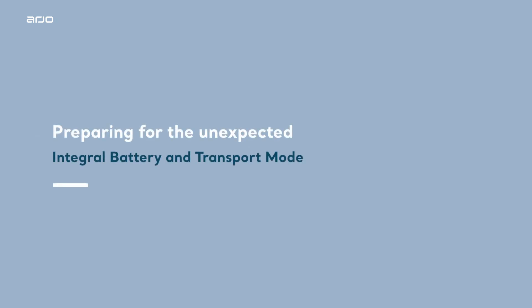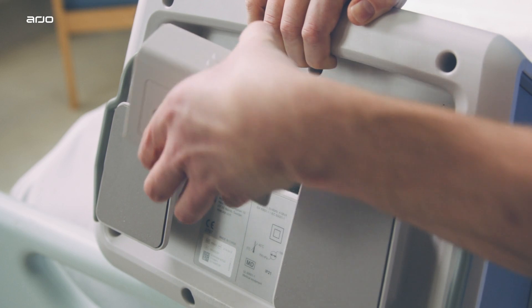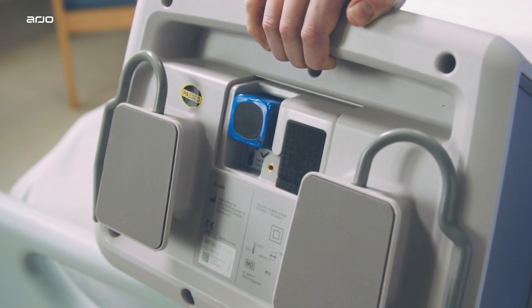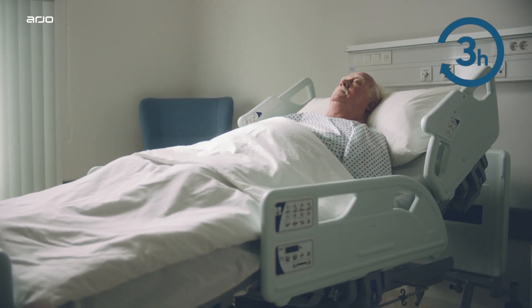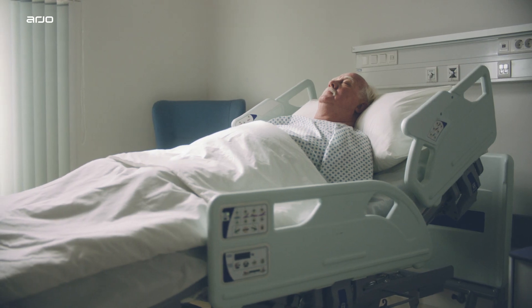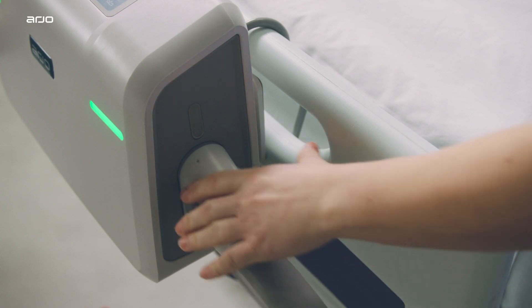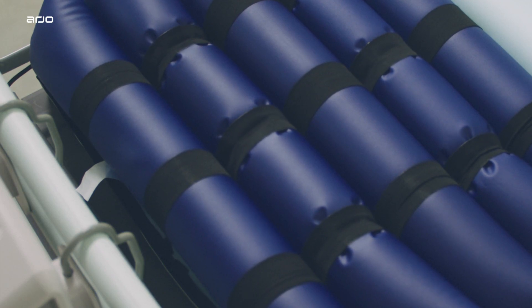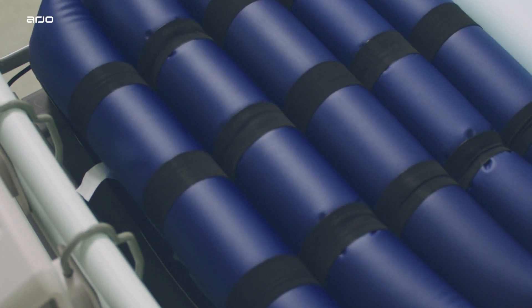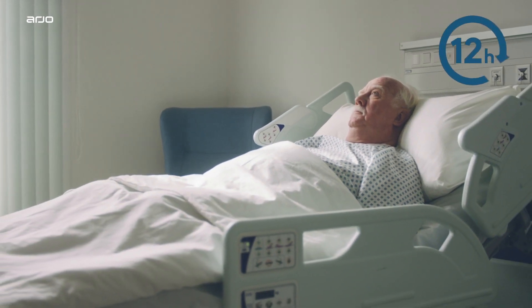Preparing for the unexpected: integral battery and transport mode. With an integral battery pack, the Oralis pump is still able to provide therapy in the event of a power cut or for active transport, ensuring at least three hours of uninterrupted alternating pressure therapy to the patient. For transport of the patient, initiate the system's transport mode by simply disconnecting the tube set from the pump. Cell pressures of the mattress will equalize and, although it does not offer active therapy, the system provides patient support for up to 12 hours.